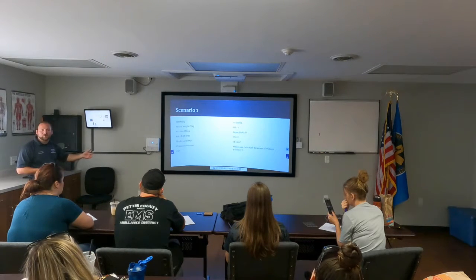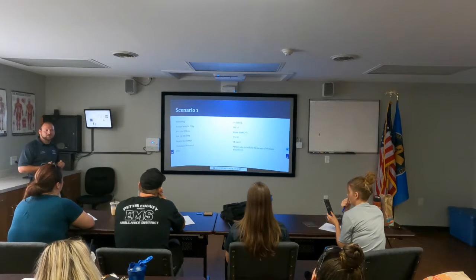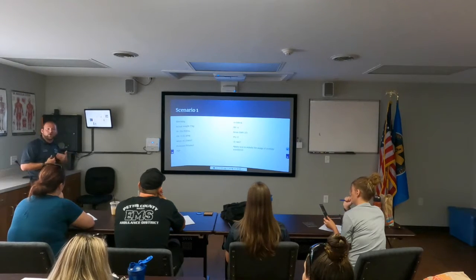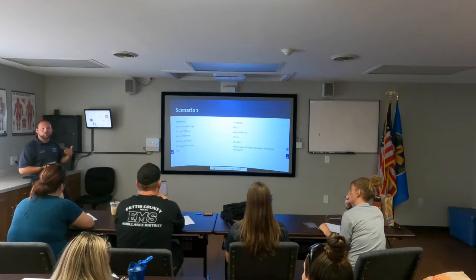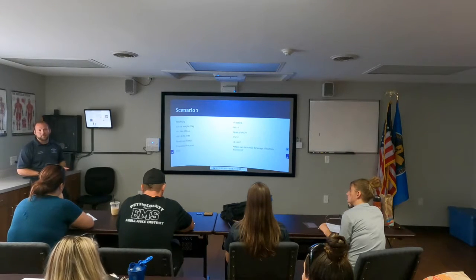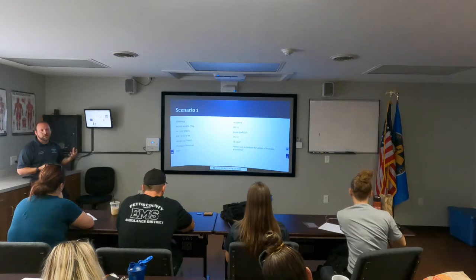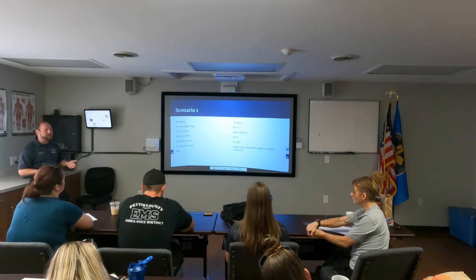Someone who's got a severe asthmatic, what do you want for your I:E ratio to be? 1 to 4 or 1 to 5. If it was pretty severe, yeah. A longer I:E ratio. Generally, most people start off at 1 to 2.5 or 1 to 3. 1 to 4 gives the time for the patient to offload that carbon dioxide before they initiate the next breath. This is going to allow, like I said, that end tidal to start coming down as we really help that patient offload that CO2.